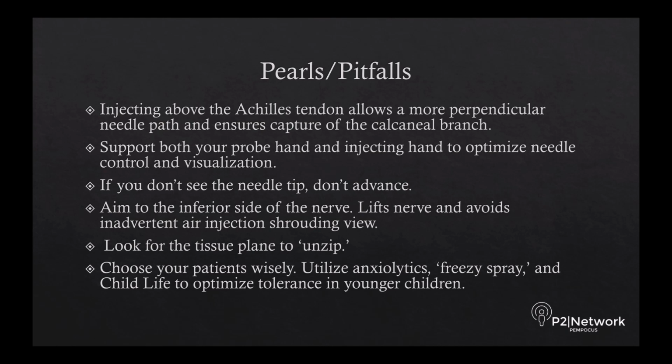If you don't see the needle tip, don't advance. This is the way you guarantee that you're not going to have inadvertent injury, inadvertent intravascular infusion, or some other complication. Aim your needle to the inferior side of the nerve. This lifts the nerve and avoids inadvertent air injection shrouding your view.